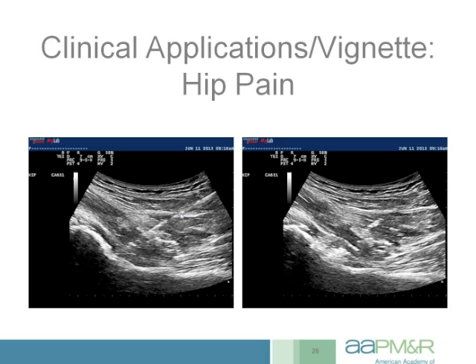And the bright line across here is the needle tracking over from inferior to superior, piercing the hip capsule and landing right here at the head-neck junction. In this image here, you can actually see the steroid solution sitting just above bone and distending up the hip capsule. So as we were talking earlier, you don't always have the advantage of contrast like you do with fluoroscopy, but you often do get a real-time appreciation of where that medication is flowing nevertheless when you're utilizing ultrasound.